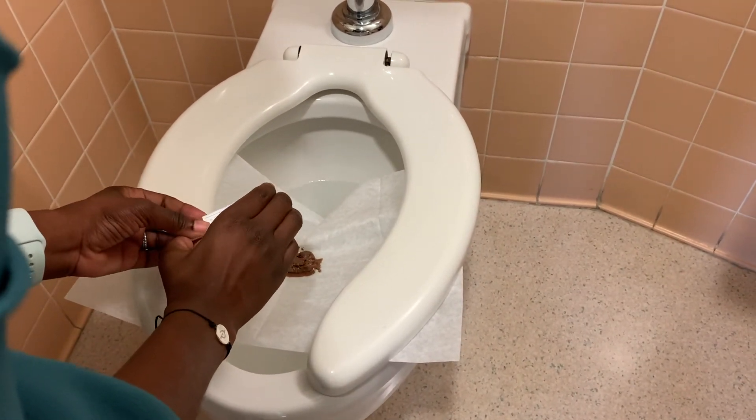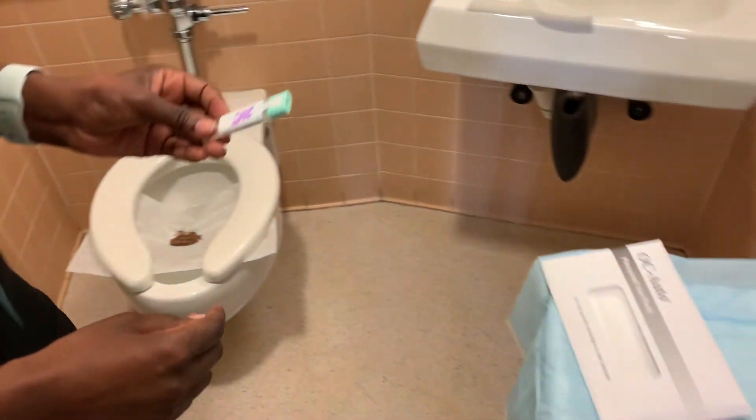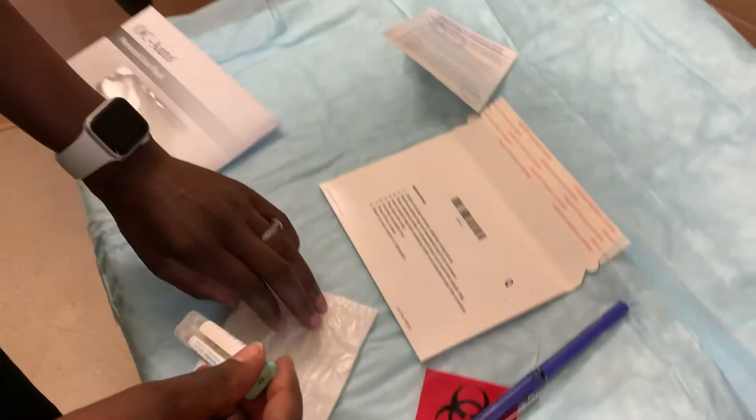And snap the kit closed. Và phải đẩy kín lại. Do not reopen this. Nhớ rằng không được mở ra.